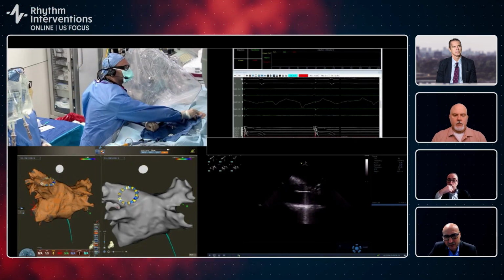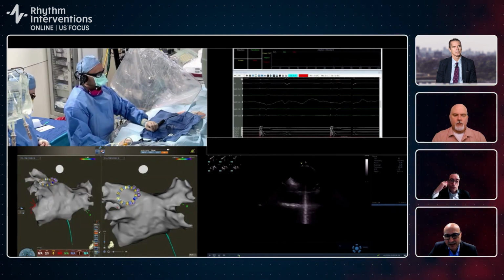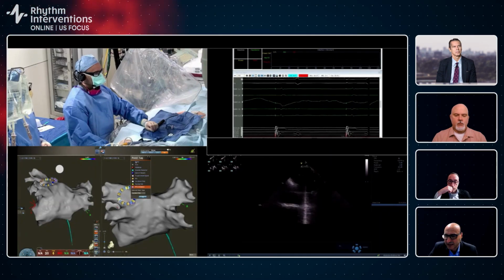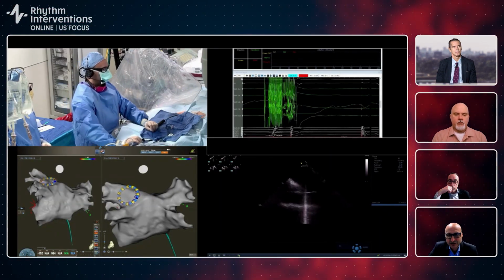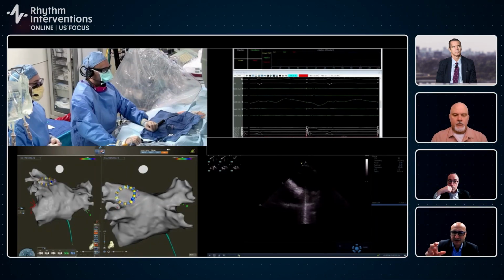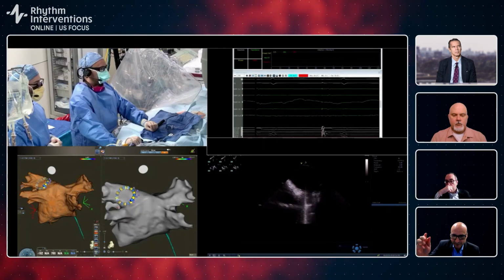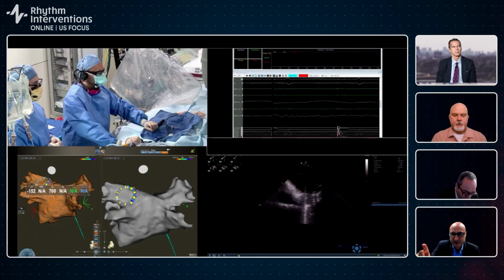And there are 10 electrodes. When they are in yellow, meaning they are in the idle mode, when they flash in red, that's when one application is performed. And as you see the catheter now, it's in the ostium of the left superior pulmonary vein. Each application consists of 3 pulses of pulse field ablation, delivered over the span of 30 seconds.